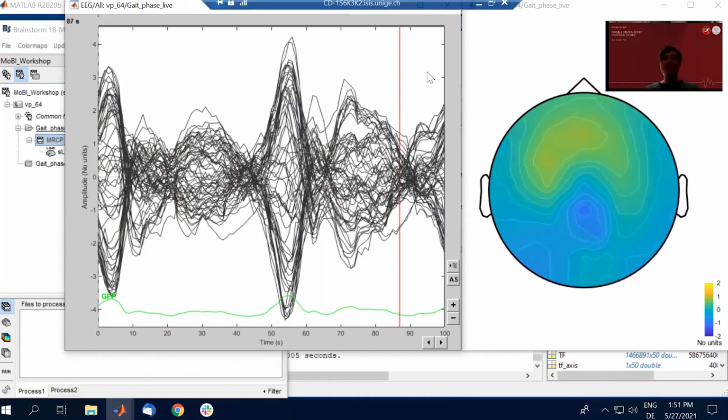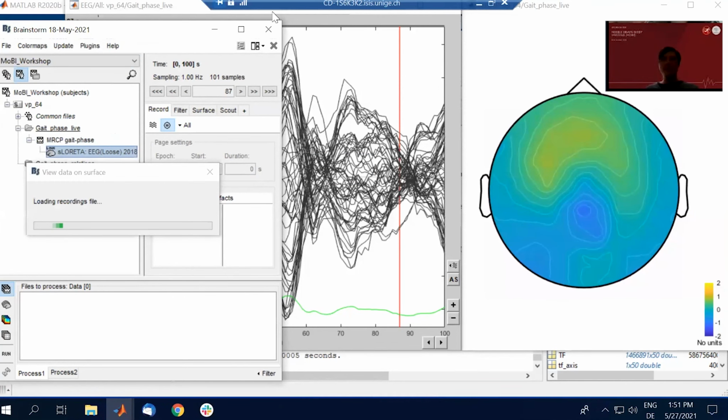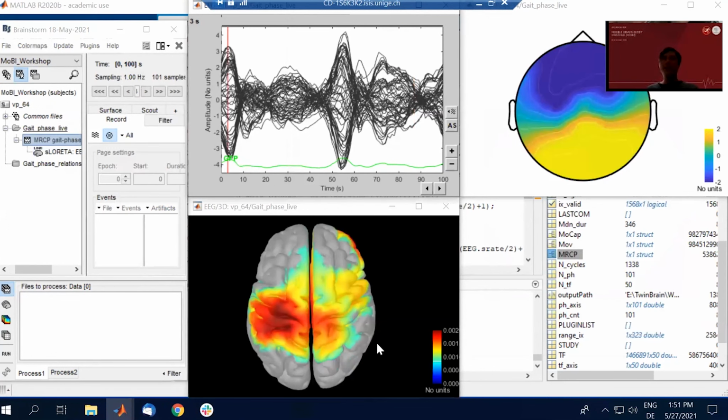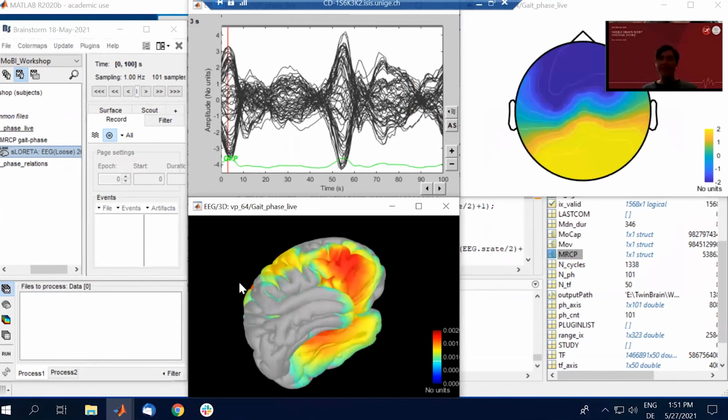Meaning what I want to do with this example is raising some awareness, again, looking at your results and then trying to find out if that makes sense or if it might be a result of insufficient cleaning. And because we did already the source imaging procedure, what comes with it is not only the topography, but also the sources. That's quite nice, I think. Because if I look at those guys, what I think they are artifacts, there's always a blob in the brain. That's the bad news. But what is the good news is somehow you can assess where this is mapping.